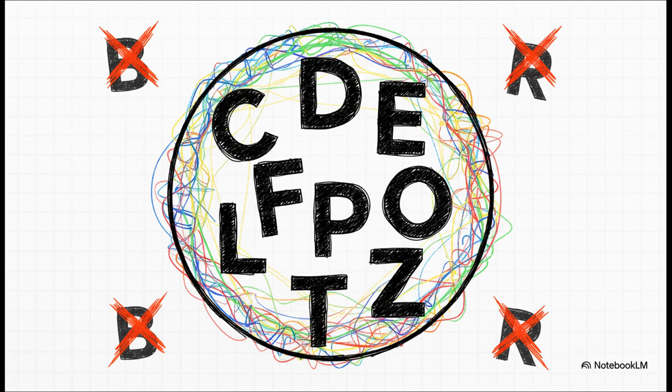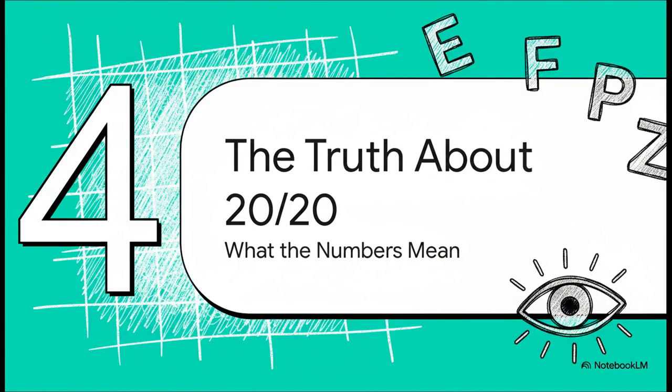These specific 9 letters were chosen because they all have about the same level of legibility when they're built using Snellen's geometric rules. Okay, here we go. This is the part of the lesson everybody wants to know about, and trust me, your patients are going to ask you about this constantly. We're finally going to decode that famous fraction so you can explain it with total confidence and precision.